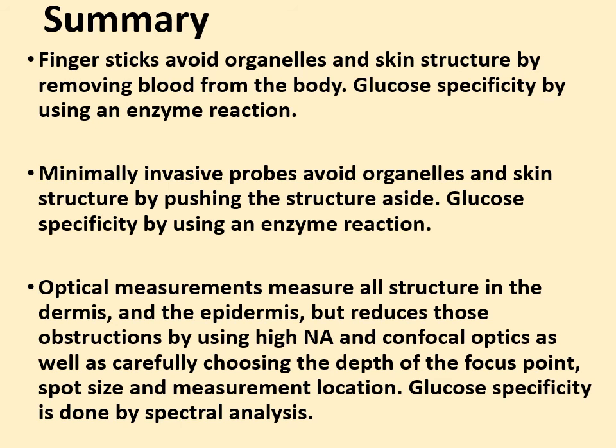And so when the probe is first put in, sometimes the measurements aren't quite right. And that's why companies like Abbott and Medtronic are working on those types of issues. And for glucose specificity, it does it just like finger prick. It has an enzyme coated on the platinum wire that reacts with the glucose and creates an electrical signal. And those last about 2 weeks before they have to be pulled out and removed.